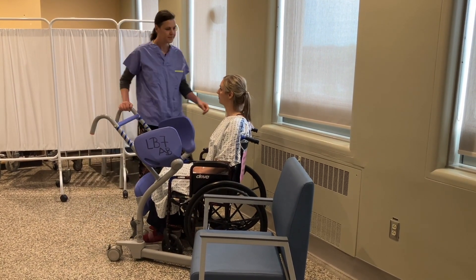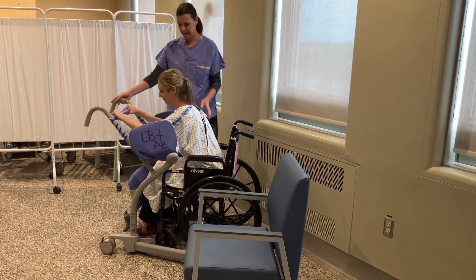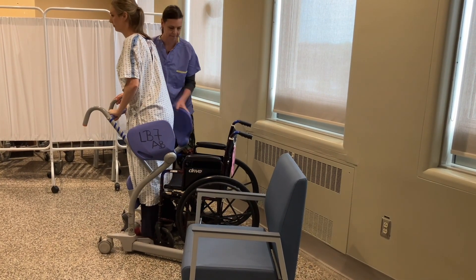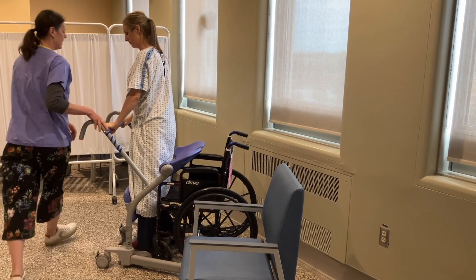Make sure you put the brakes on. The patient reaches for the handrail and pulls themselves up into standing. The paddles are then positioned so the patient can sit down on them.